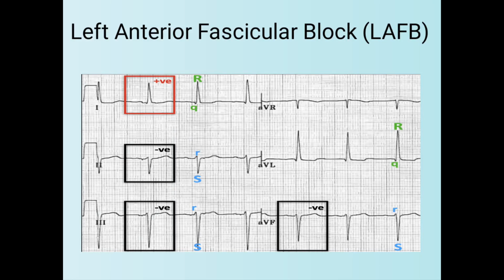Friends, in this video of ECG basics, today I will talk about left anterior fascicular block.